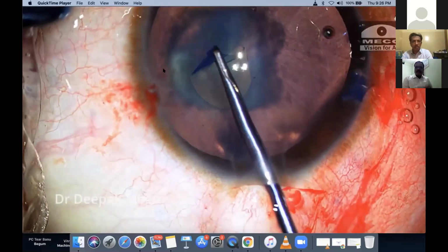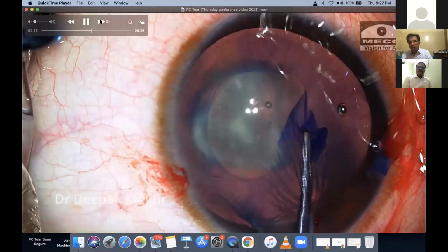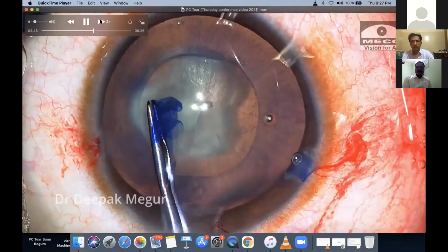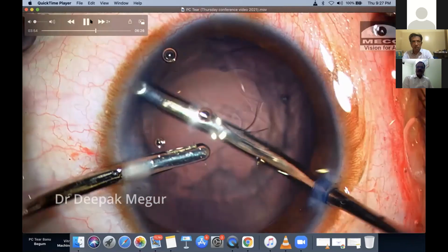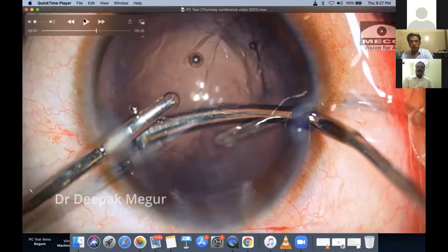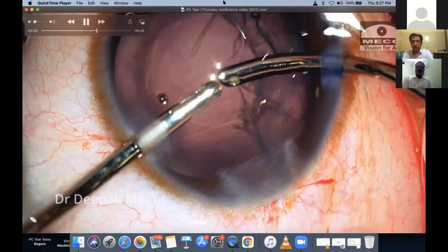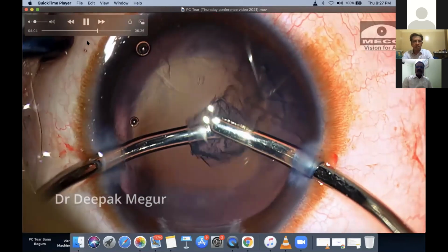Now, moving on to the next case. This is, again, a very young patient. I'm not thinking that it's a polar cataract. Everything was looking fine. It was just a routine case. So I did not do anything special here. The cortex is being aspirated. The nucleus was removed, soft nucleus was removed. And the cortex is being aspirated. So far, so good. There is no posterior capsular tear at this stage.